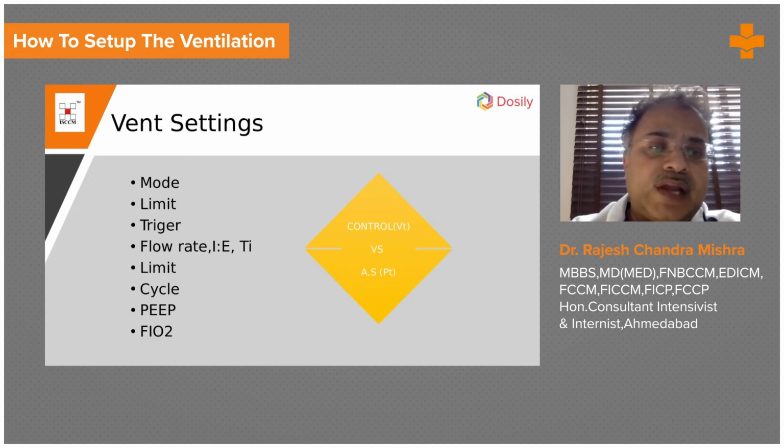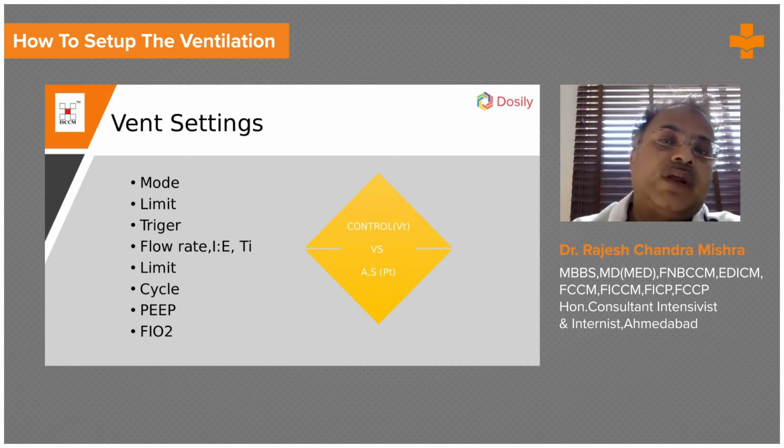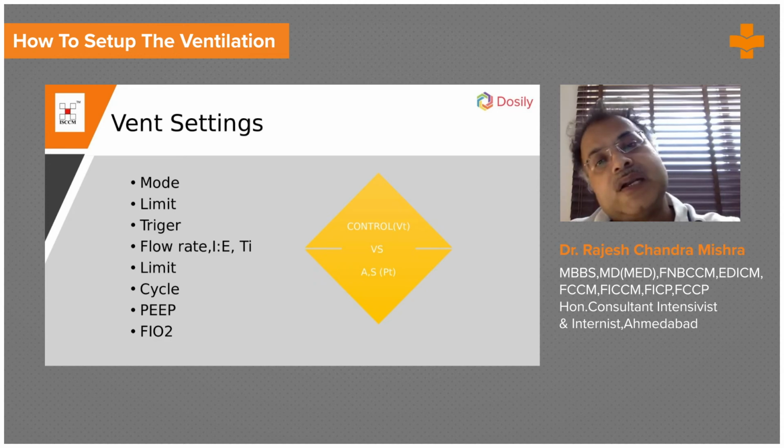The patient will not be allowed to cycle if inspiratory time or flow rate is fixed. So if you find a lot of cycling problems, then you have to change the mode or put the patient on spontaneous ventilation, so the patient can decide the cycle also, to avoid patient-ventilator asynchrony. To begin with, we start a PEEP of 5.